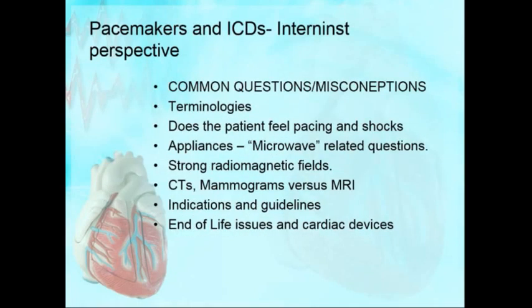So now questions that you want to know from the internist perspective, common questions that people would want to know. The terminology: does the patient feel pacing and shock? This has been asked multiple times. People say, well, I have a pacemaker. Do I feel my heart when I pace? The answer is no. You do not feel the pacemaker pacing you.